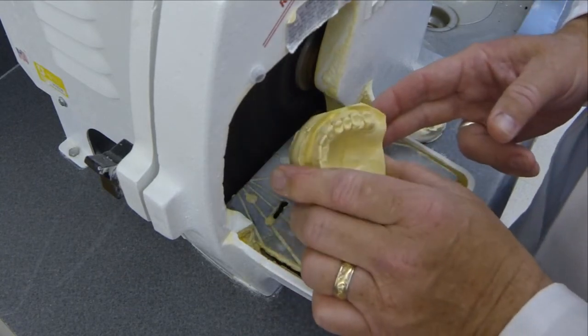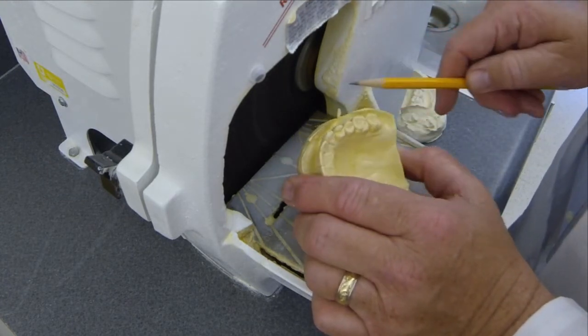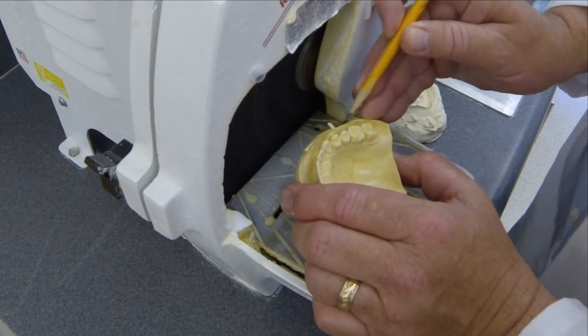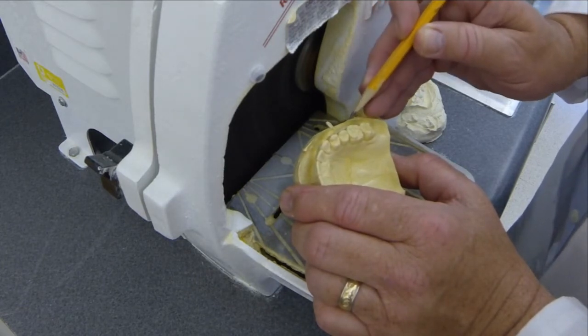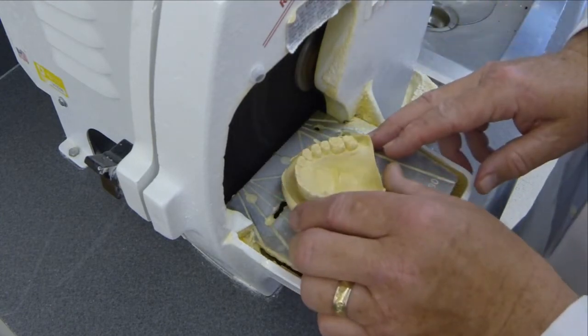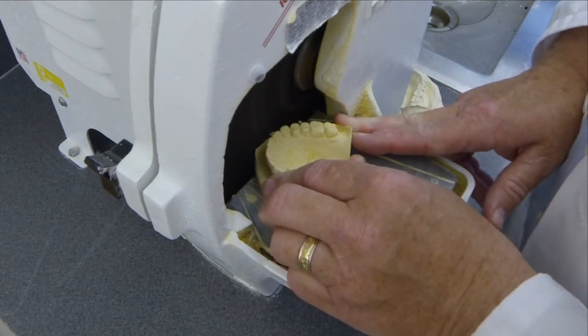I'm going to stop at that point because we want the depth of this vestibule here to be approximately 1 millimeter, and yet we want to have this area trimmed to where it's about 1 to 2 millimeters thick. I've actually over trimmed this slightly in this area. Now we're going to do the other plane, going to the midline to cuspid.